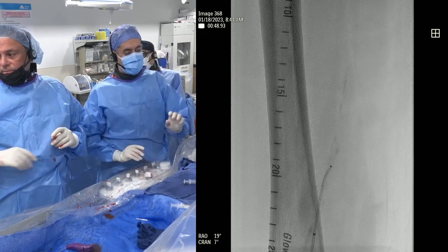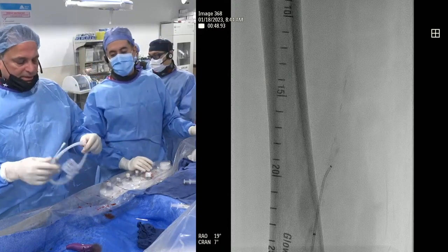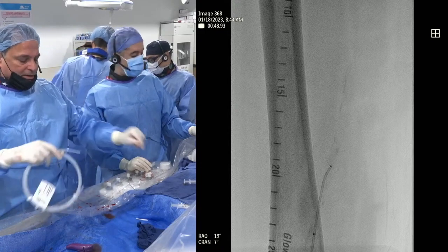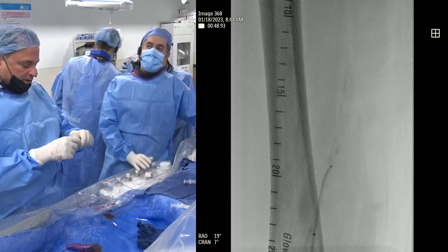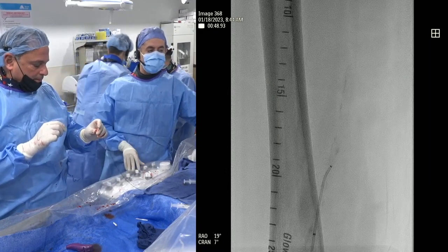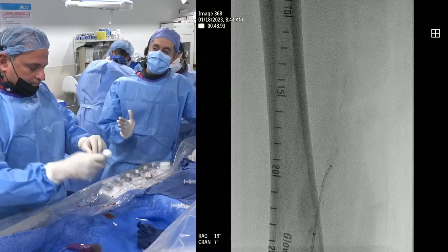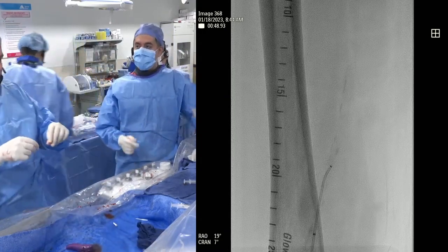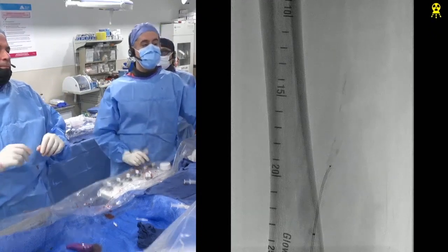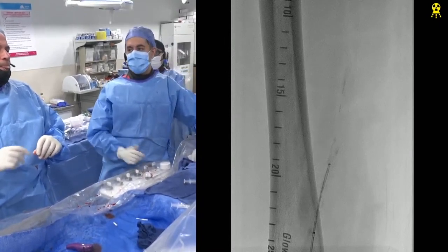I think we should be able to, it's worth trying, so that way you don't push the dissection out further. Yeah, that's what I'm trying to do, and then it becomes harder to use the Outback. So I'm just going to go ahead and I have a Command extra support here, 014, 018. We're going to get the Outback. I'm sure Karthik has seen, or Srini as well, once you have a lot of dissection plane, the hematoma actually pushes onto the true lumen. It can collapse it. Now it becomes even harder to go with the reentry. Correct. And it makes a bigger false lumen. Exactly. You don't want to compromise your true lumen to a point that now you really have no lumen to enter into with your wire.